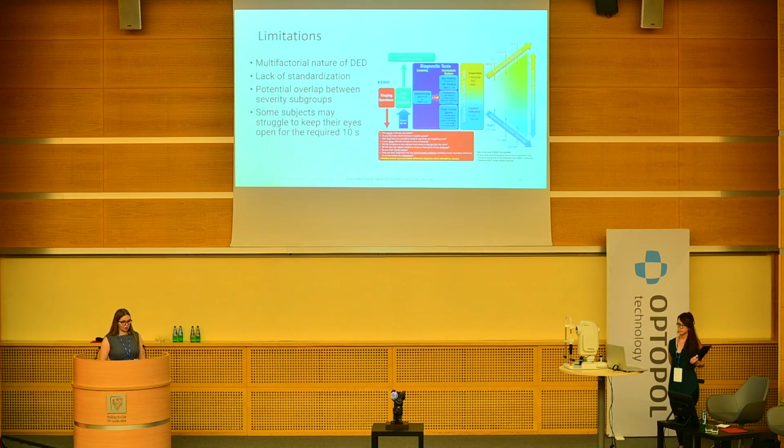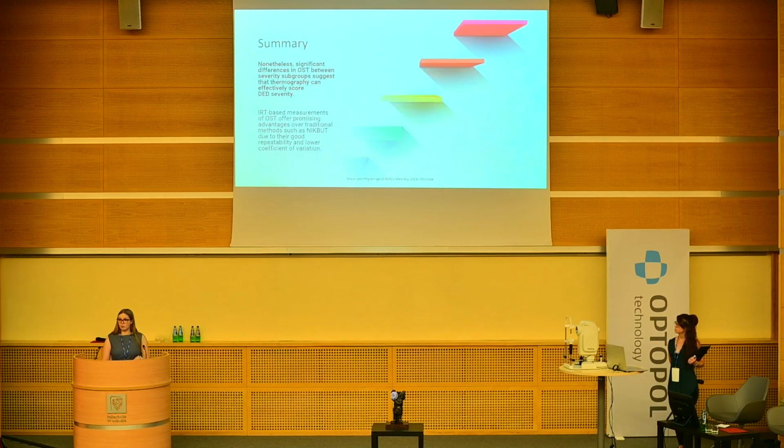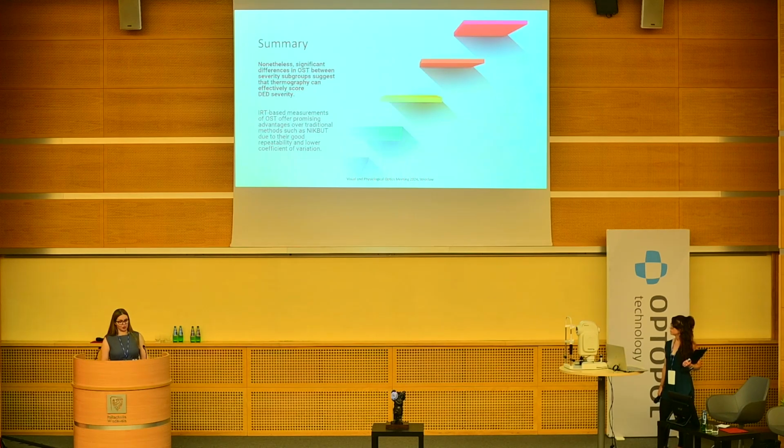But the ocular thermography showed significant differences between groups, even though the groups were pretty close to each other in terms of severity. It shows that it works and it could be used maybe instead or maybe as a support to tear film breakup in the future for diagnosis.